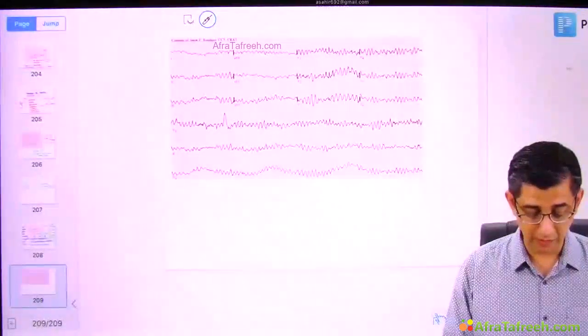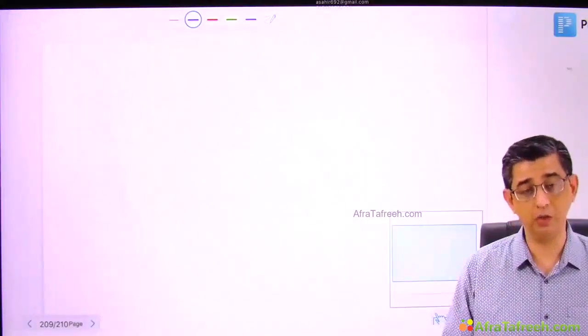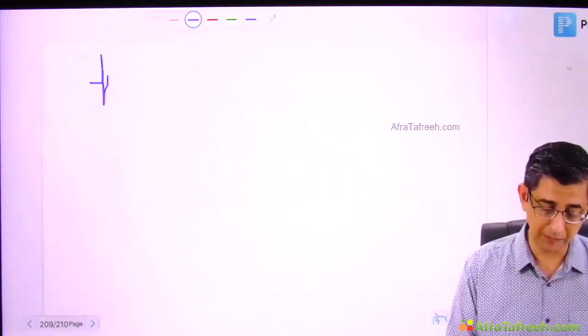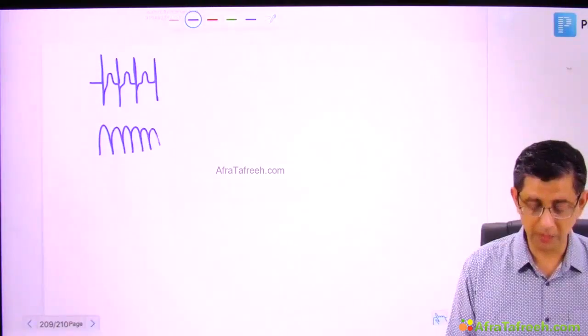So let's just make a summary here as well. And this summary will again help you realize the aspects with respect to QRS complex specifically. Abnormalities of the QRS complex is what I've highlighted. I have taught you regarding narrow QRS complex. This was PSVT as I highlighted. I've also taught you regarding situations causing a broad QRS complex.